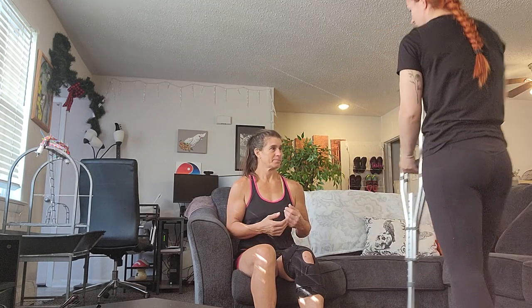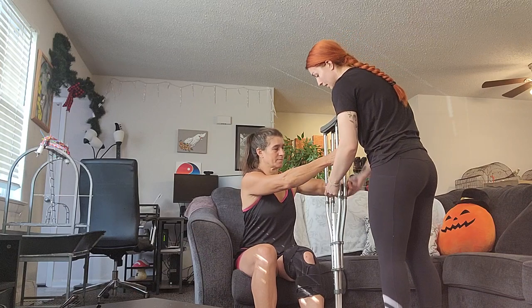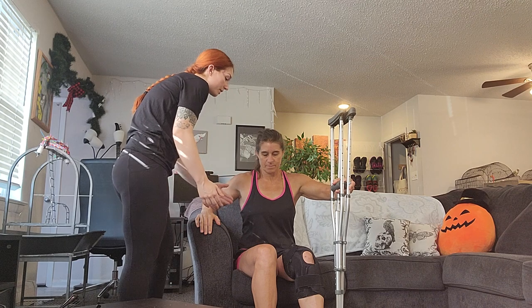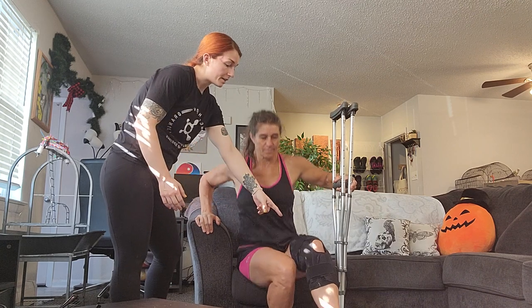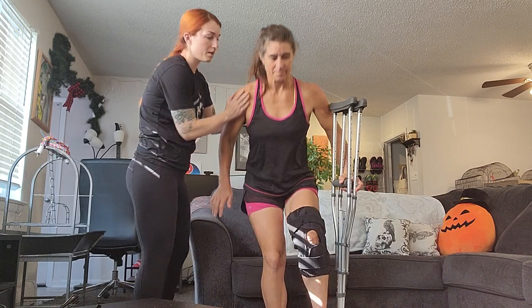So let's get you these crutches. We're gonna start on one side — you're just gonna hold on to this side here. Now we're gonna have you push off from over here. If you need to scoot forward a little bit, feel free. Try not to put any weight on that side. So I'm gonna support you here. Now lean into that leg and up.